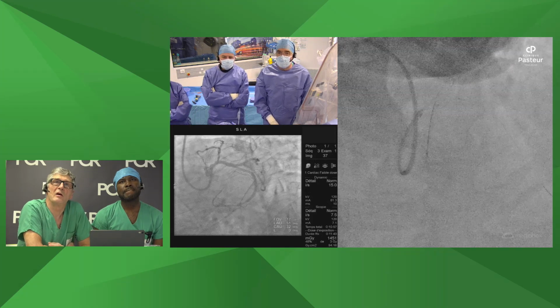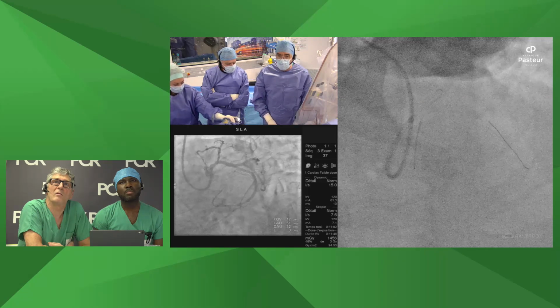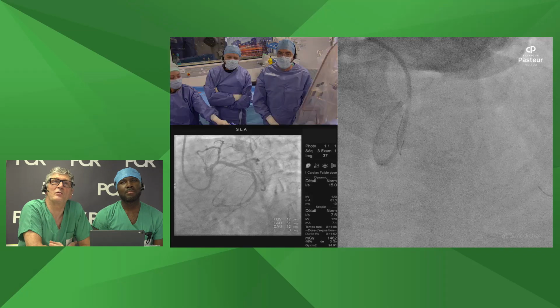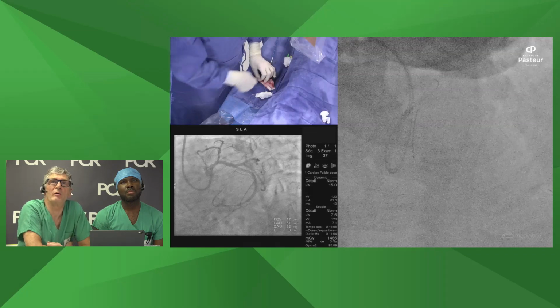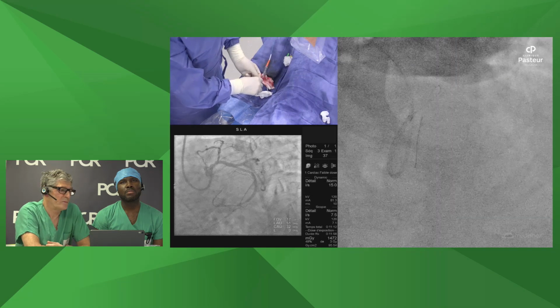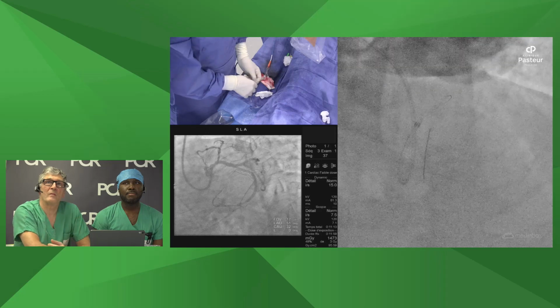Yeah, sure. With another one. But take care because you remove the wire. I'm removing the wire, yeah, I see. You can use a third wire to just be sure that 33 will be okay. Okay, we can do that. So with the radiopaque part of the wire that is 30 millimeter, it should be good. We can do that.